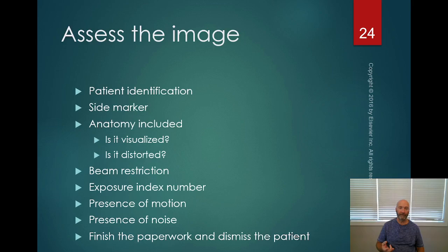In every hospital I've ever worked in, both of them were part of the patient identification that went on the image. So patient name, patient number, the date of the exam, the institution, and some hospitals will use date of birth as well. That would be 5 different things most of the hospitals I've worked in used.